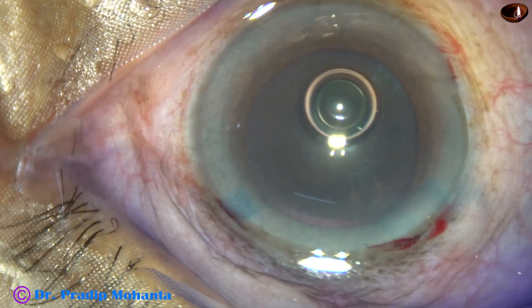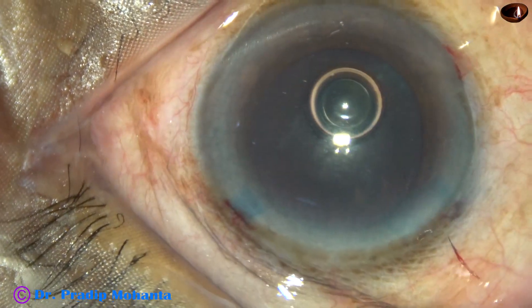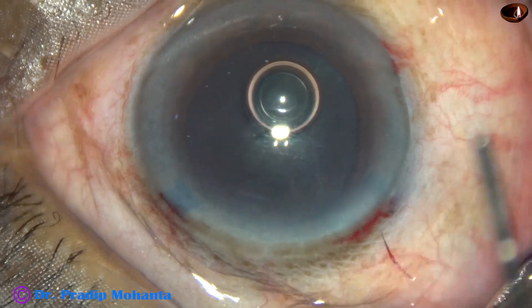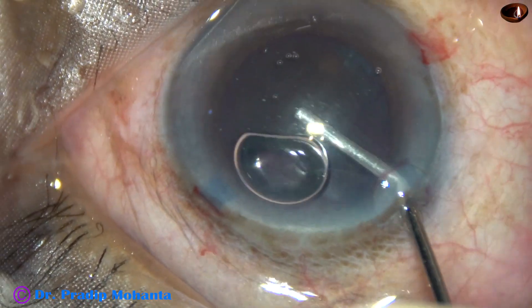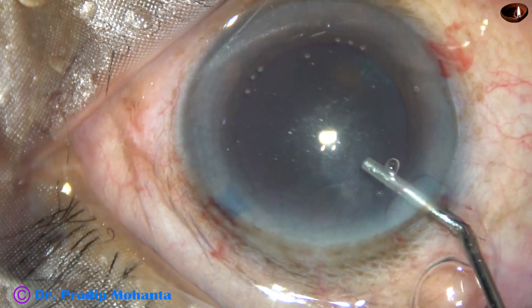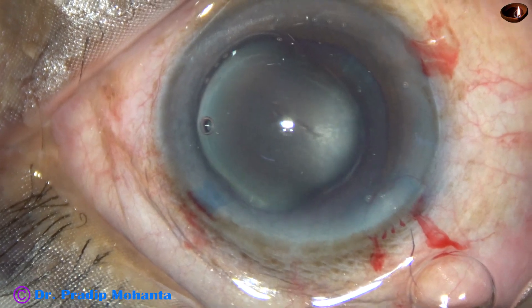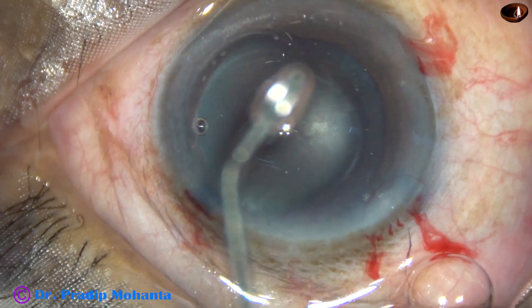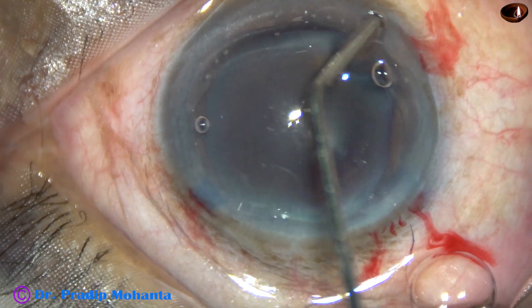The staining is done, the dye is washed out, and now 2% hydroxypropyl methyl cellulose is used to fill up the anterior chamber. The visco is applied over the corneal epithelium and this improves visibility.